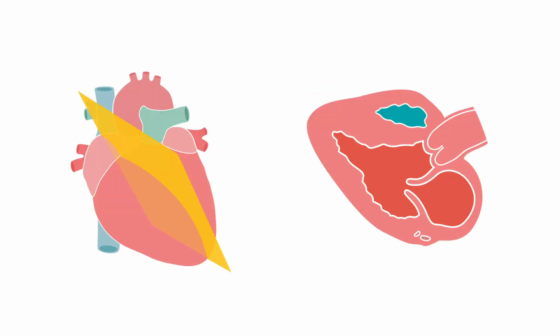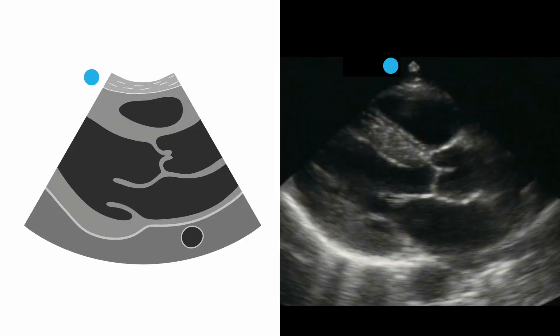This is the image orientation you want to get. You should have your right ventricle on the top of the image, your left ventricle adjacent to it, the left atria, the mitral valve in between, and the aortic valve. Here's what it looks like on ultrasound: right ventricle on the top of your screen, left ventricle, mitral valve, left atrium, and your aortic valve.